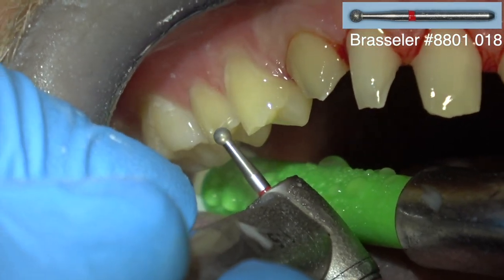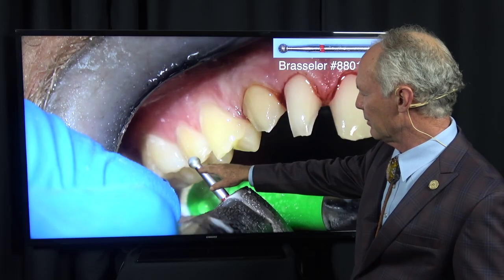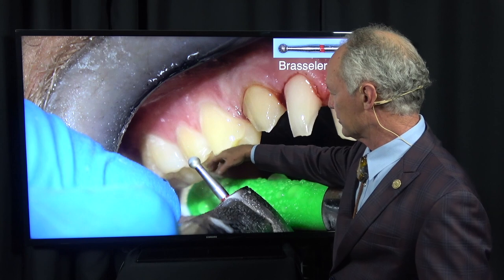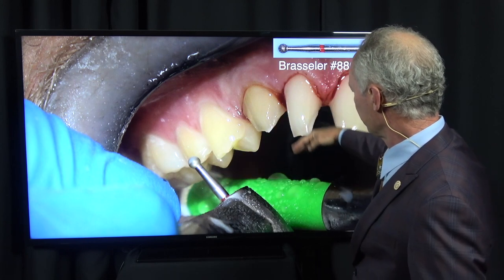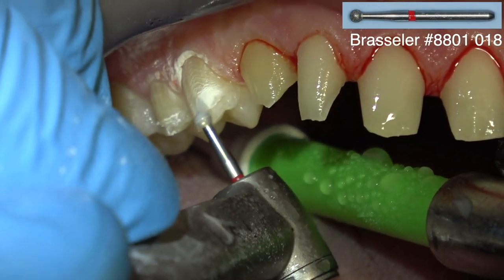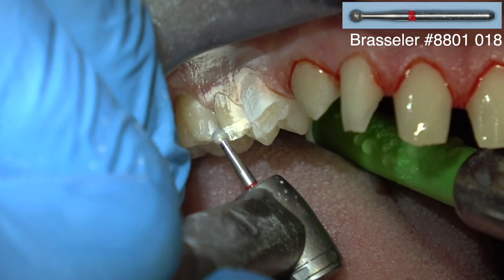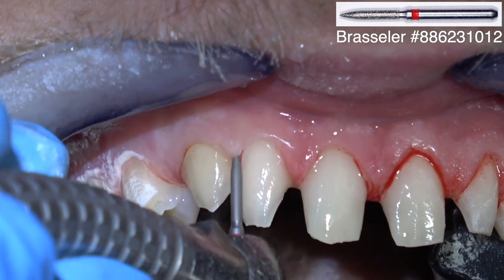So these are the lugs, and you only cut them on the bicuspids, or if you're veneering a molar, you do the same thing because you're not including the occlusal surface on the bicuspids or the molars. On the cuspids and the other anterior teeth, you've got a flat incisal edge, and that's your stop for the veneer when you're seating it. This is about a half a millimeter, but with a definitive floor, so the veneer stops when you're seating it.